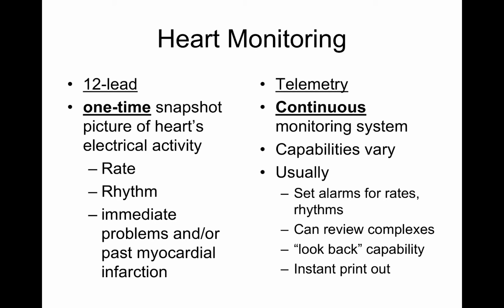We're going to talk more about that when we get into 12 leads, but it will give you a clear definition. How a 12 lead works, and it will make more sense when I show you an example, is it takes 3 seconds, 3 seconds, 3 seconds, and 3 seconds at a time. So from start to finish, when the technician or the nurse takes a 12 lead, they will push start. It will go for 12 seconds and take a snapshot and different views of the heart over 12 seconds.